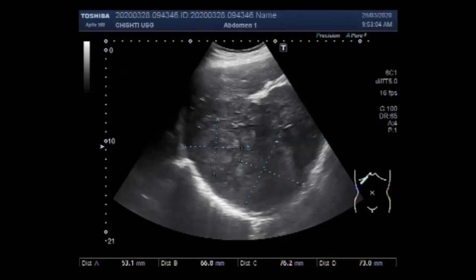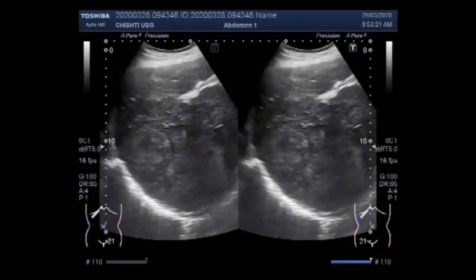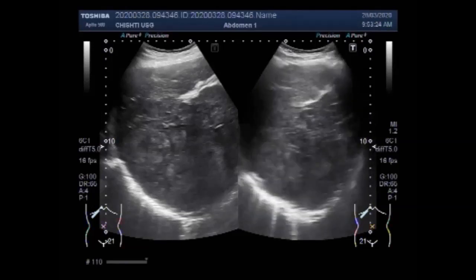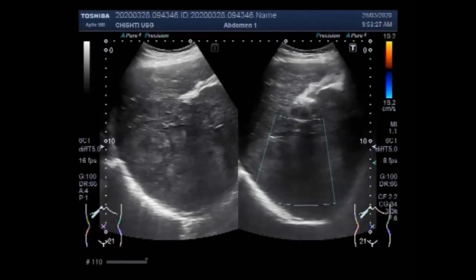No fluid is seen in or around the mass. This is the other mass. Now you are going to see the blood flow in the mass.